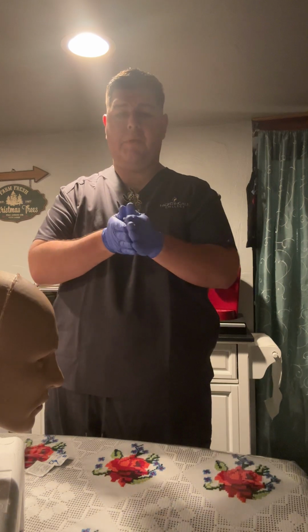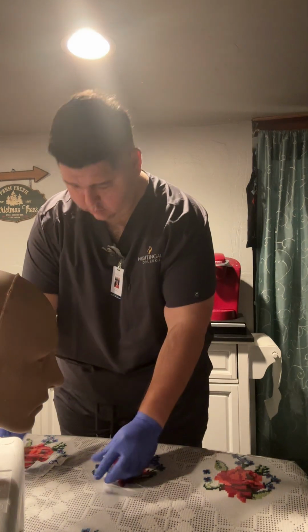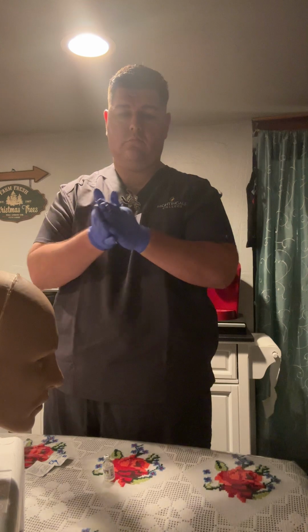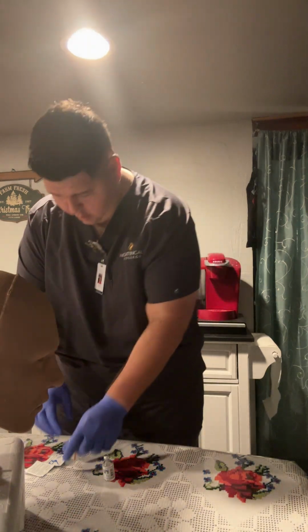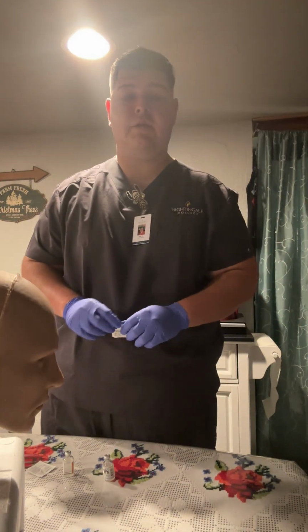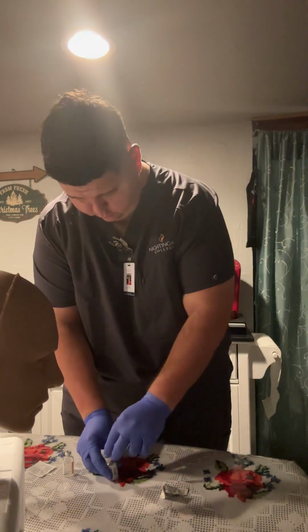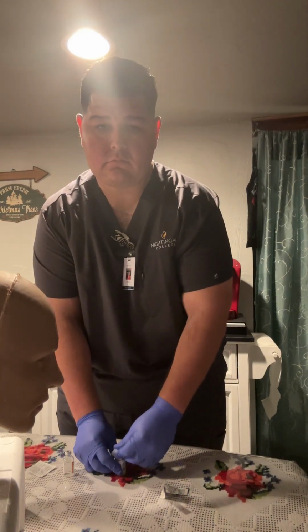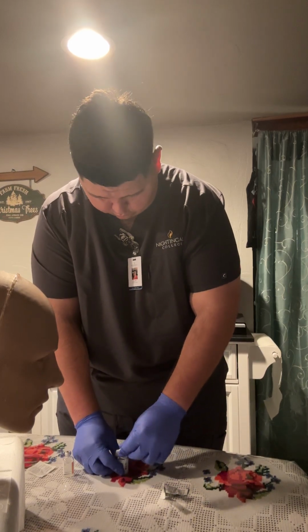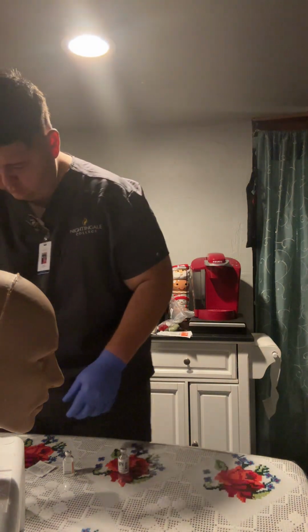Okay. So at this point, I want to take my NPH insulin and roll the vial, rolling the medication in my hands. At this point, I want to clean the top of the vials with the alcohol pads. I will discard the wrapper, put it in my trash.